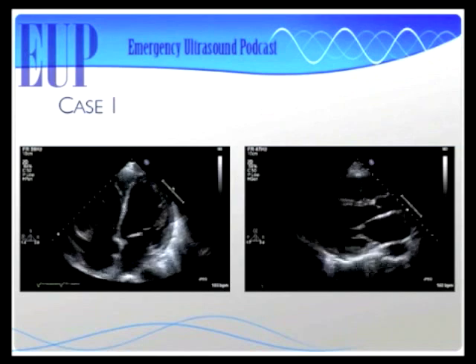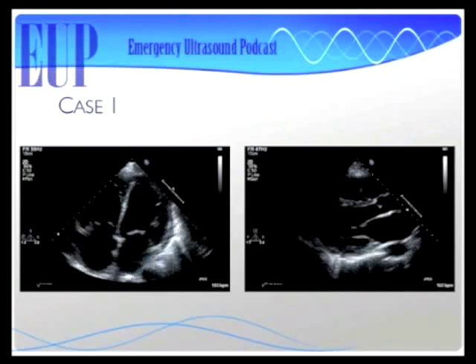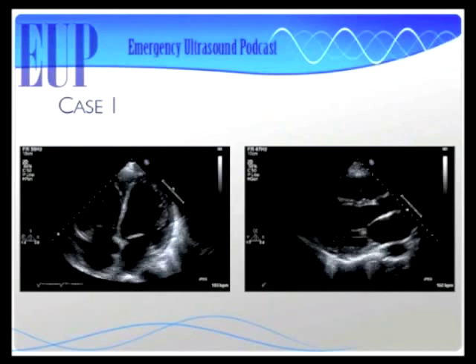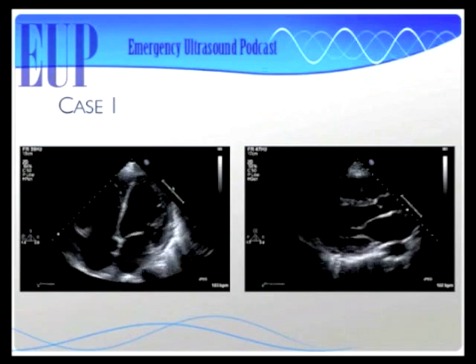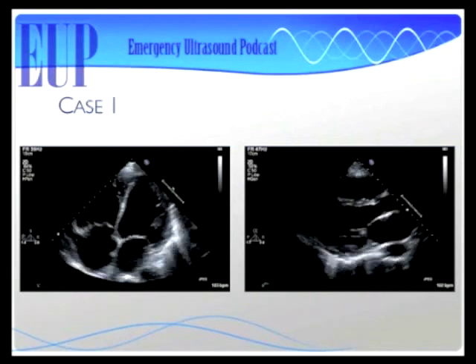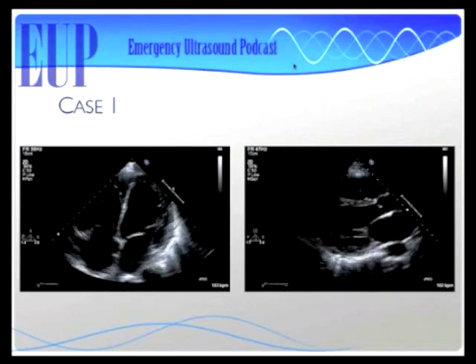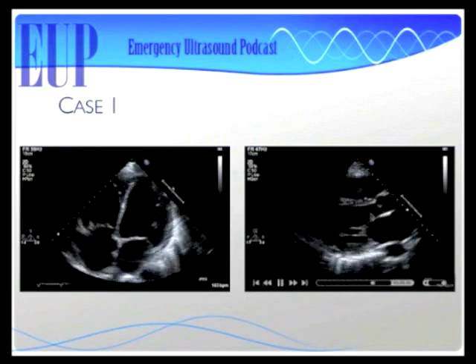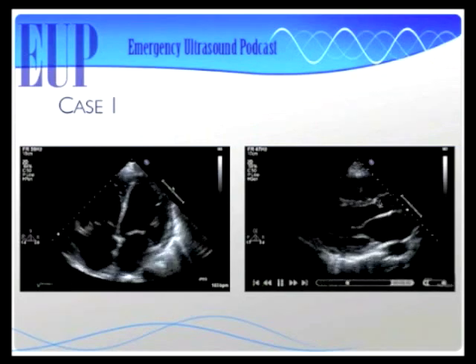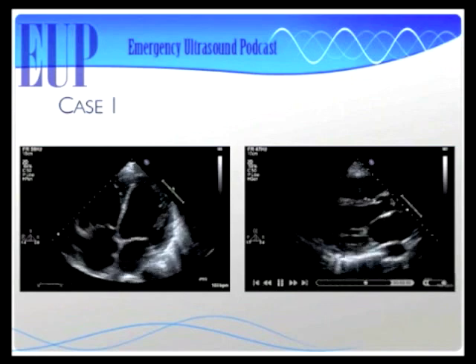Genius. So this heart is not squeezing hardly at all. This EF is significantly reduced. This person is in a world of hurt, right? So you look at this and you can tell just grossly that the heart itself is not squeezing very well. The ventricles are barely moving at all. When the valves open, they barely open. Like if you look at the aortic valve in that parasternal long axis, see how it sort of pops open for a second and then almost immediately closes? That's because the cardiac output's so low that it barely has to stay open at all.